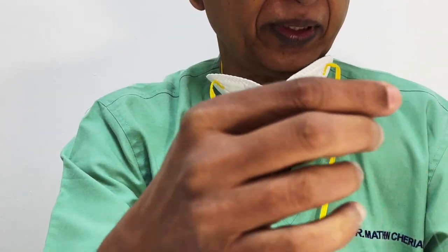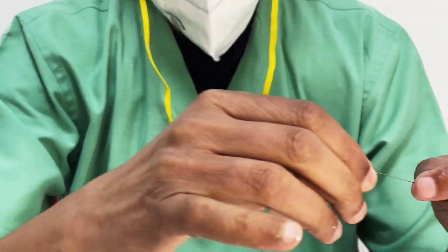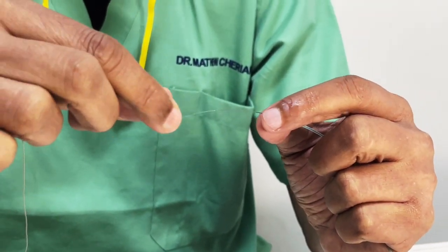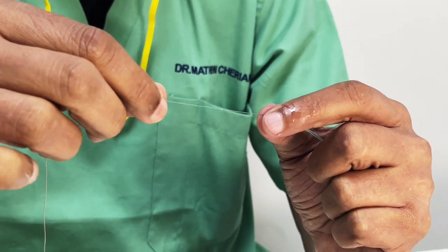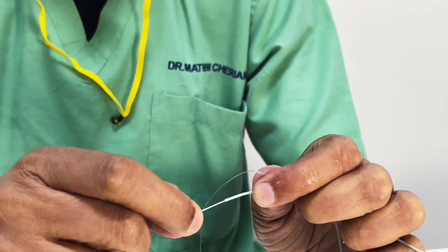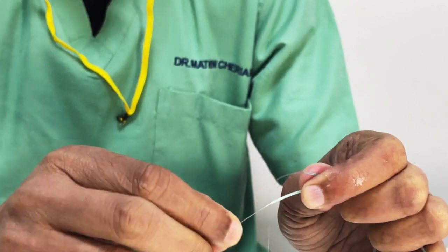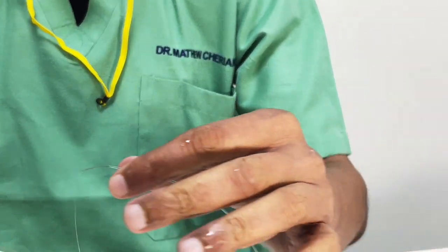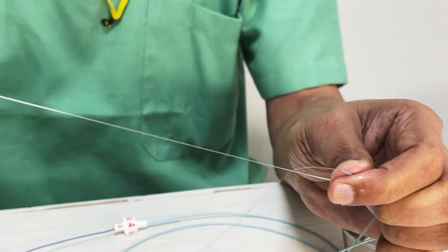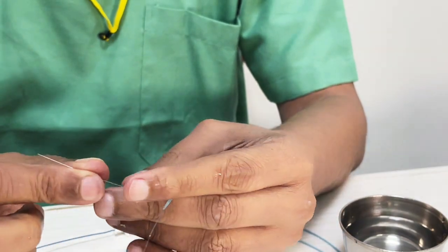So these are non-fibered. The second thing about it, it has got a detachment zone. Unlike the other coil which I showed you, the coil from Boston Scientific, which you push and detach, here it can be pulled in and out several times because the detachment is either mechanical or electrical. So I can pull it back, push it out, pull it back and push it out. And interestingly, when the coil is inside a microcatheter, it won't detach. It has to come out and come in contact with blood for an earthing to take place.